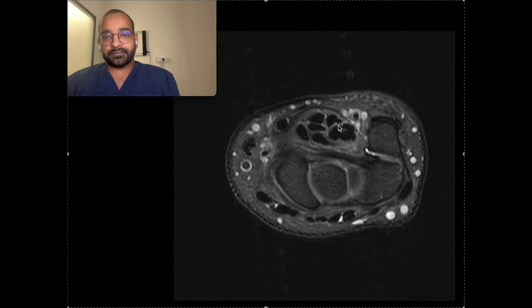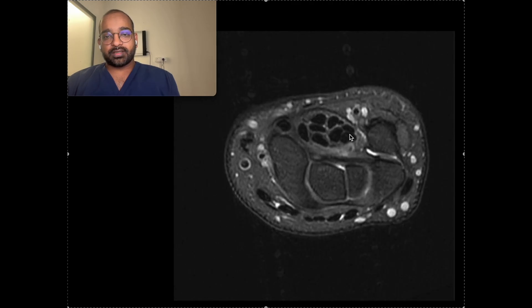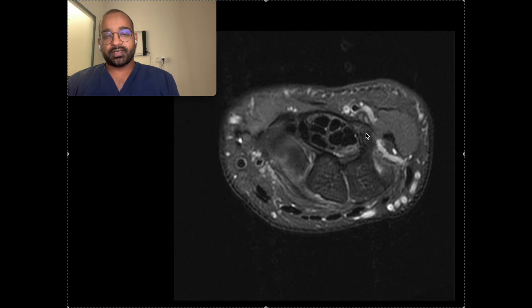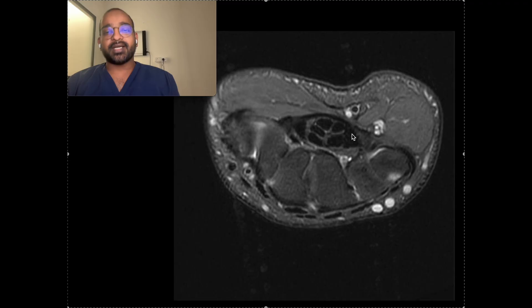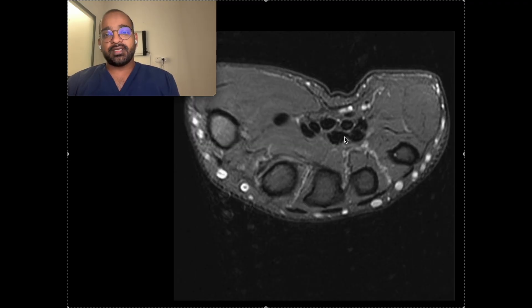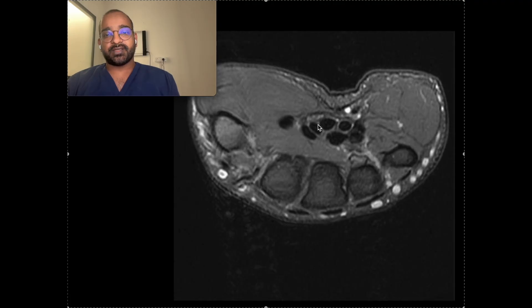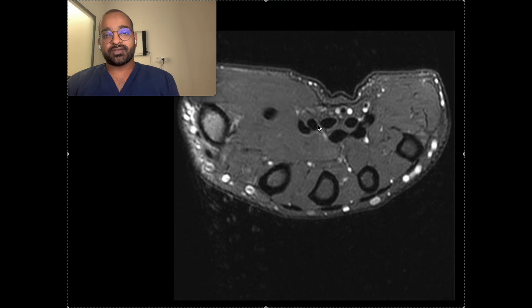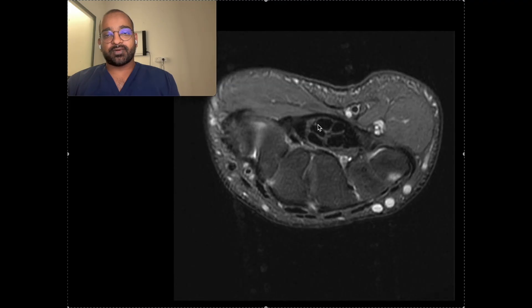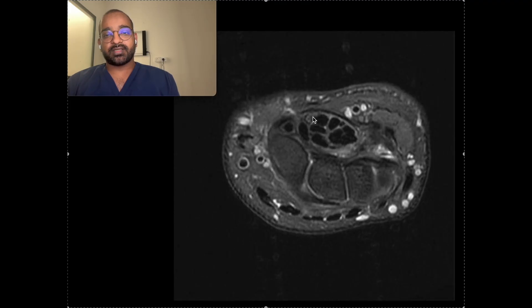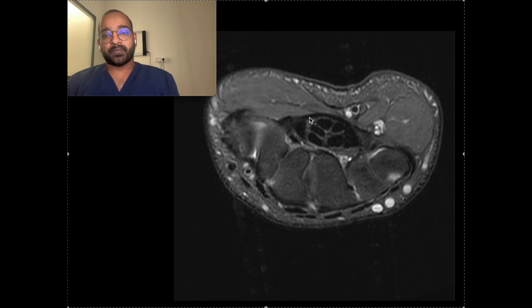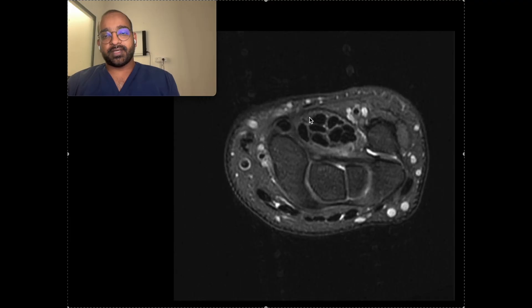What you are seeing here is the carpal tunnel. The contents of the carpal tunnel are the flexor tendons and an oval-shaped structure — going a bit more proximally you can see this is the median nerve.